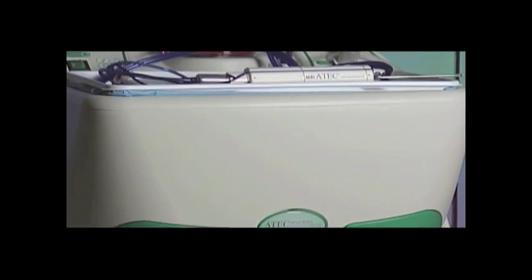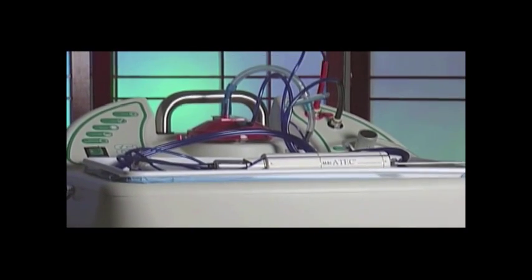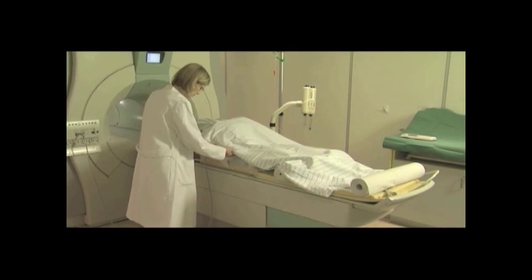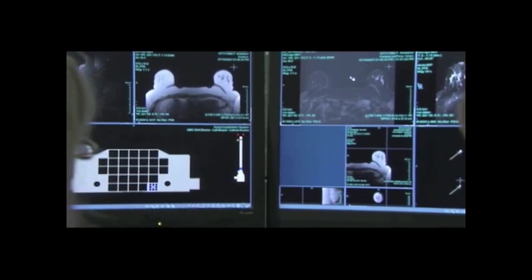Both systems are compatible with most magnets, breast coils, and targeting software. In this video presentation, we will demonstrate the grid method using interventional targeting software.